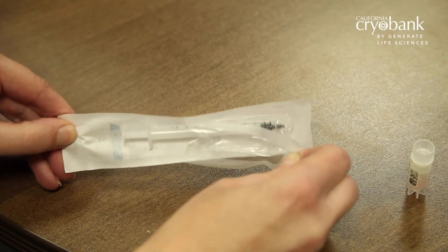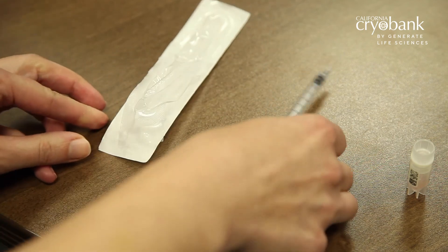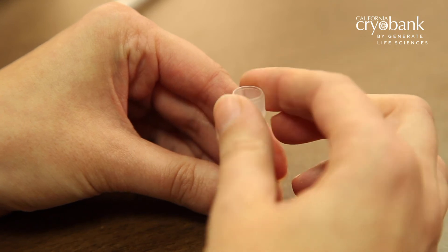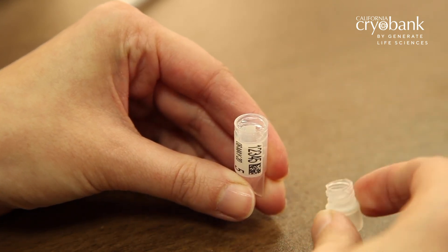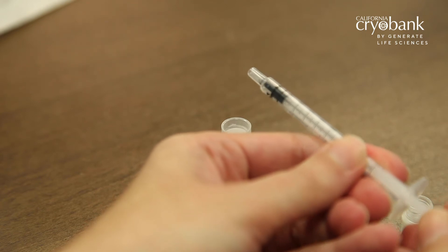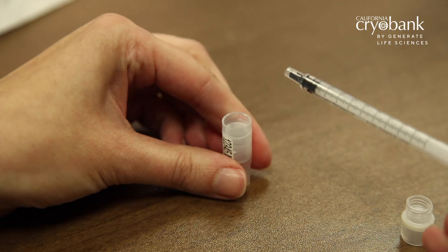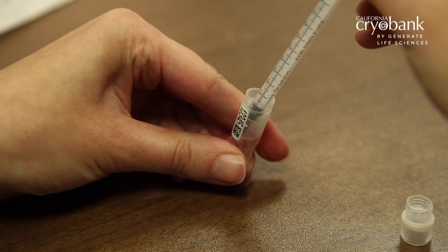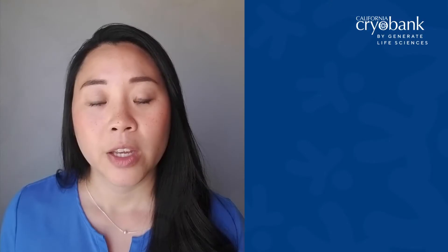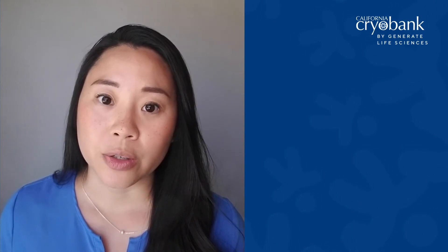Peel back the tabs on the syringe package and remove the syringe from the packaging, then set it aside on a clean surface. With one hand holding the vial in an upright position and the other hand on the vial cap, slowly unscrew the vial cap by turning counter-clockwise. Set the vial cap down and pick up the syringe. Before inserting the syringe into the vial, pull back on the syringe plunger to draw in a small amount of air, then push on the plunger to expel the air out. Then slowly insert the syringe into the vial and draw out the entire content into the syringe — be sure to insert slowly to prevent any spillover. If the solution is too thick to draw into the syringe, allow it to sit at room temperature for no more than 30 additional minutes to liquefy. Once the specimen is in the syringe, you can proceed with the insemination process. Please see our instructions for basic insemination guides.